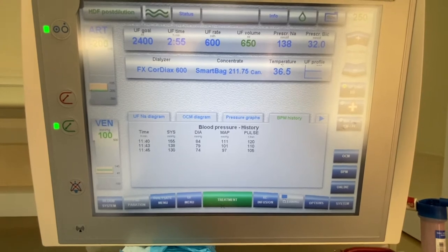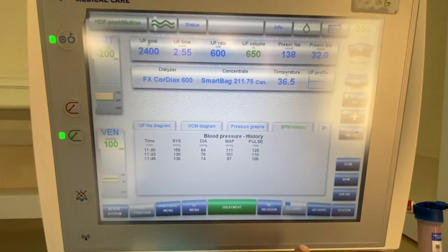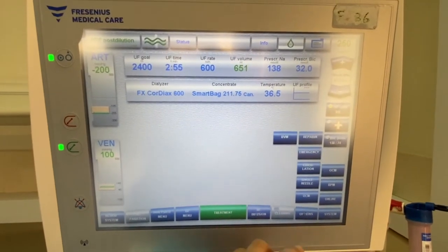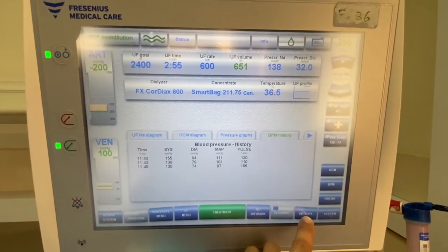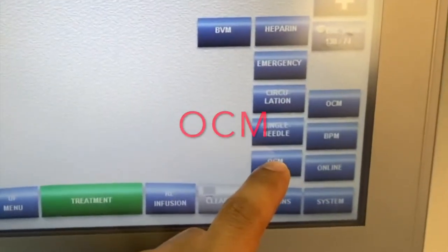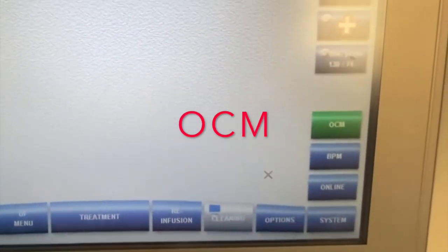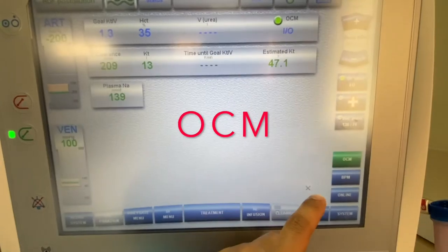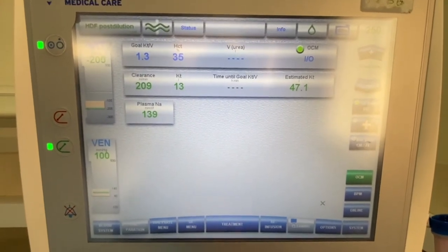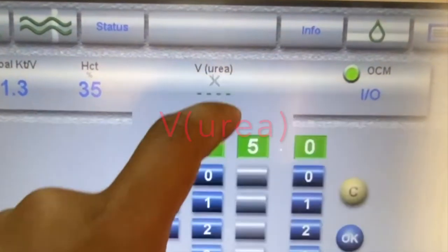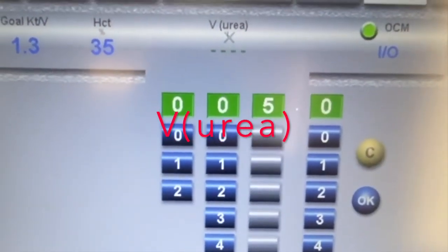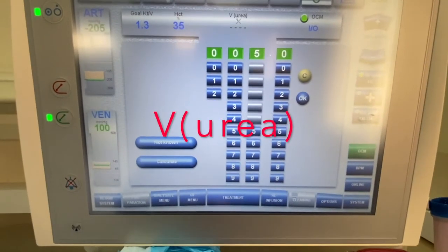This is how we set our KT/V overview in the machine. First, you click on the options or directly pick OCM on the screen, and you will be prompted with the OCM menu — Online Clearance Monitoring.